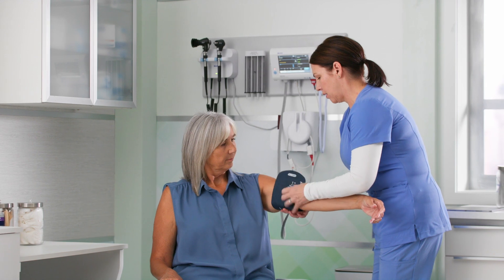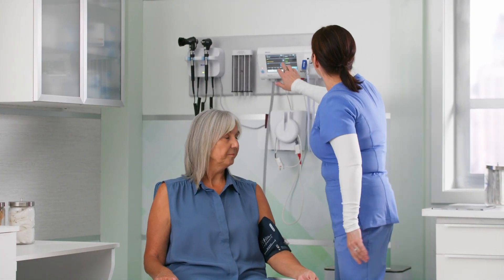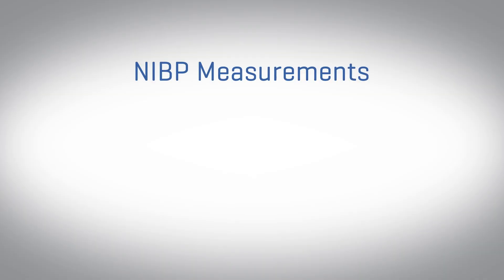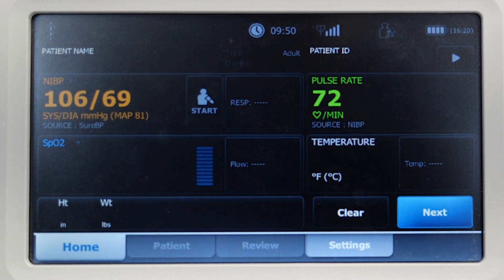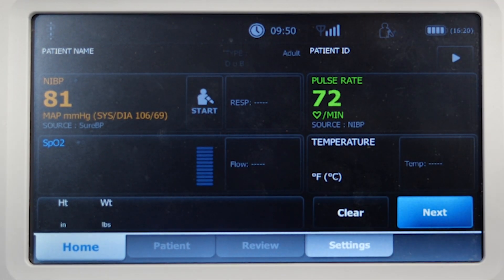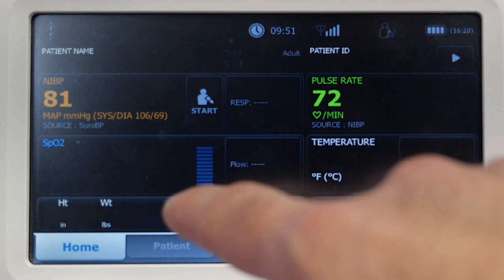Now that we've discussed proper use of the blood pressure cuff, let's move to the function of the patient monitoring devices themselves. They utilize touchscreen technology and will enable you to take single, averaged, or interval NIBP measurements. Readings can be taken from the NIBP tile, and as a user, you can choose to visualize the systolic and diastolic numbers or the mean arterial pressure. To do so, touch the tile to toggle through.